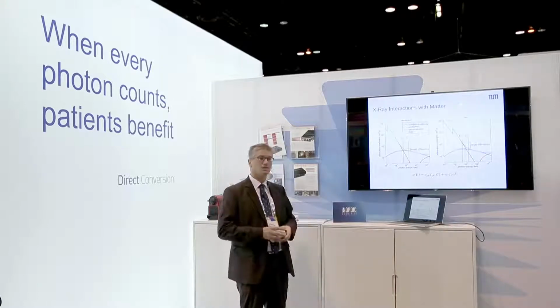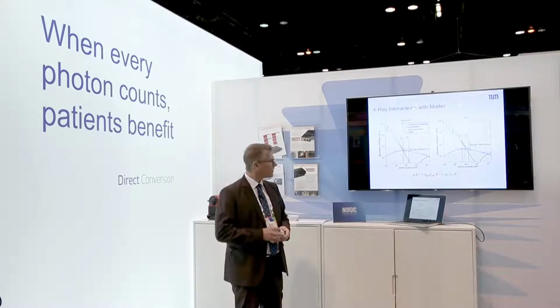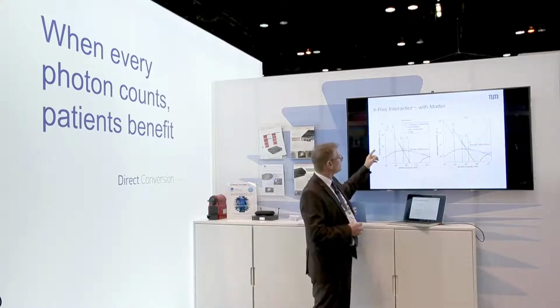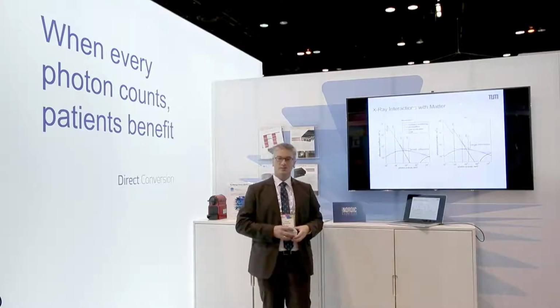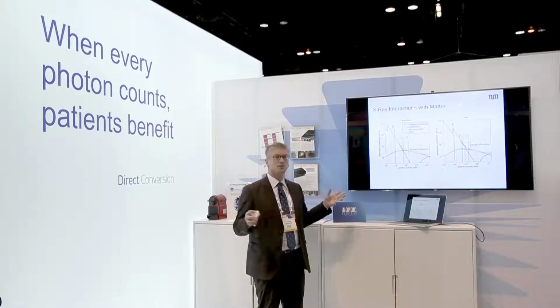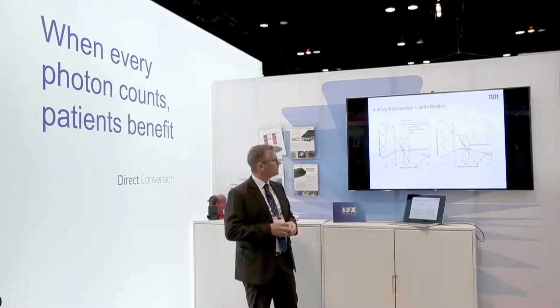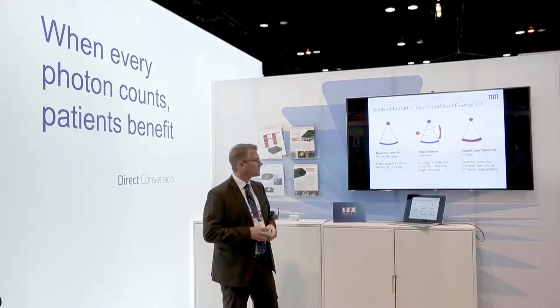So we can be energy and material specific by measuring two different energies. Of course, if you look closely, you also see that there are additional features in the photo effect, for example, the edges. If we also want to use these edges to discern between different materials, obviously we have to measure even a third energy to get more information on the samples.